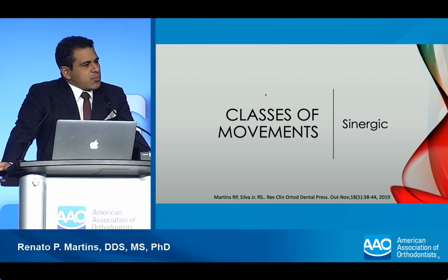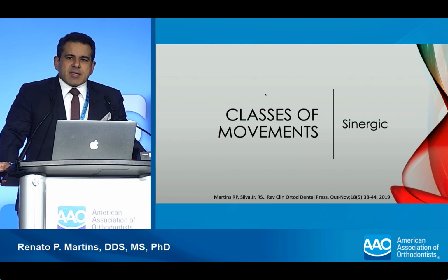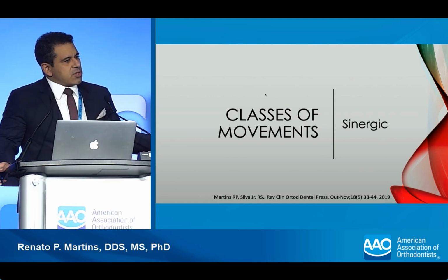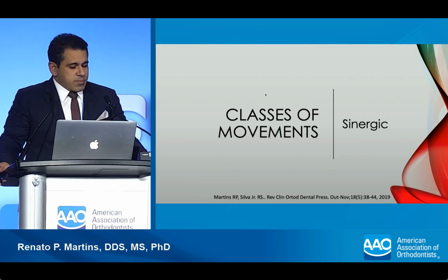The synergic class of movement is very similar to what we talk about in fixed mechanics and we call a consistent force system. It's when the force and the direction of the side effect of the force are what you really want or are your objectives of treatment.